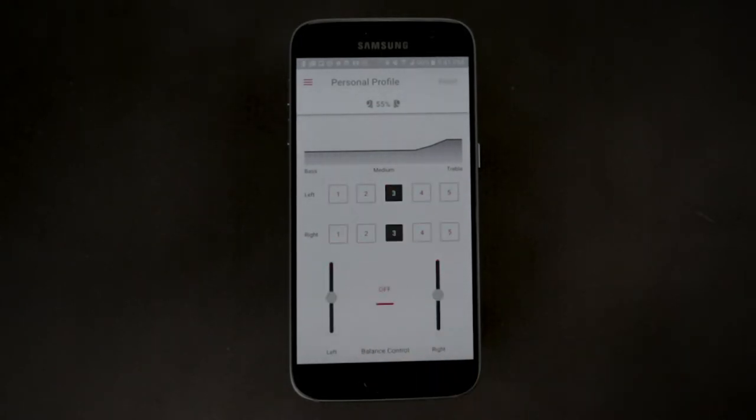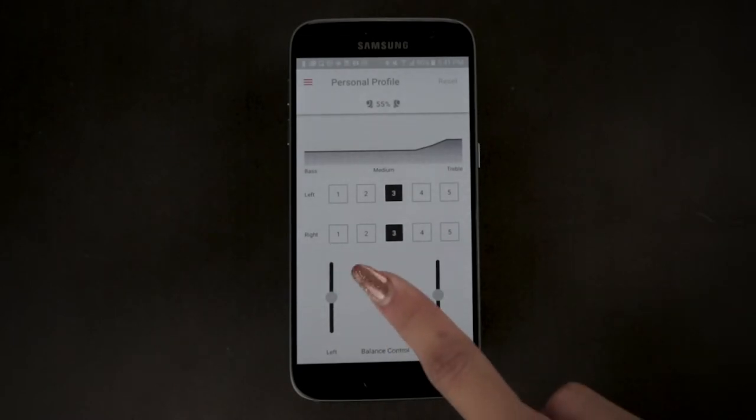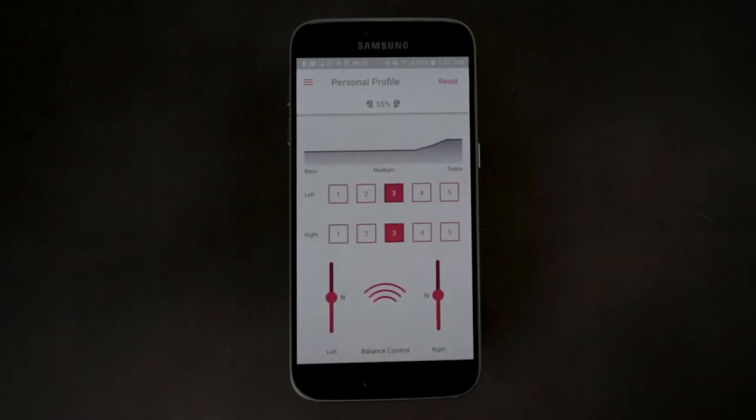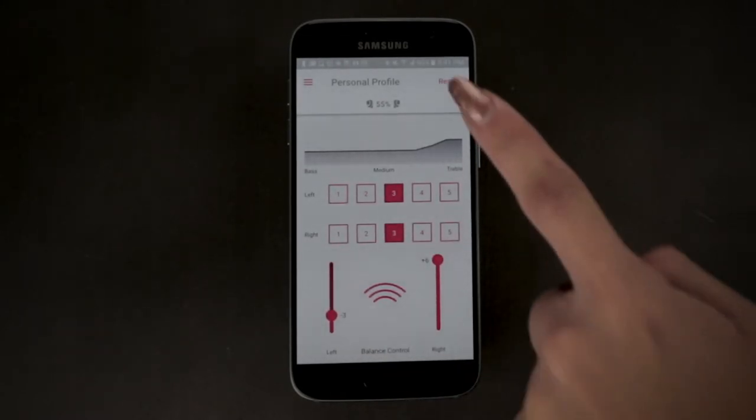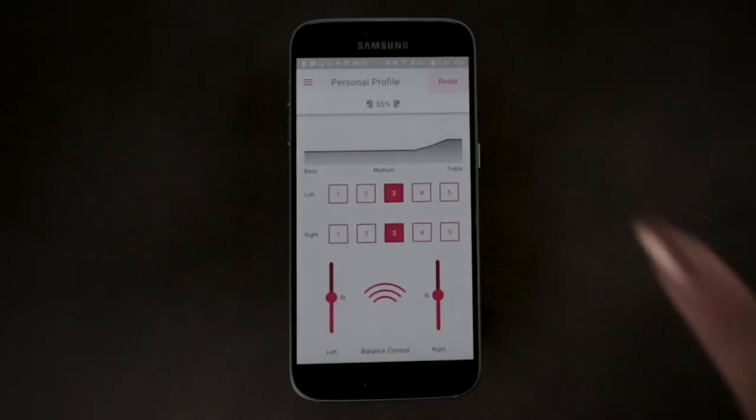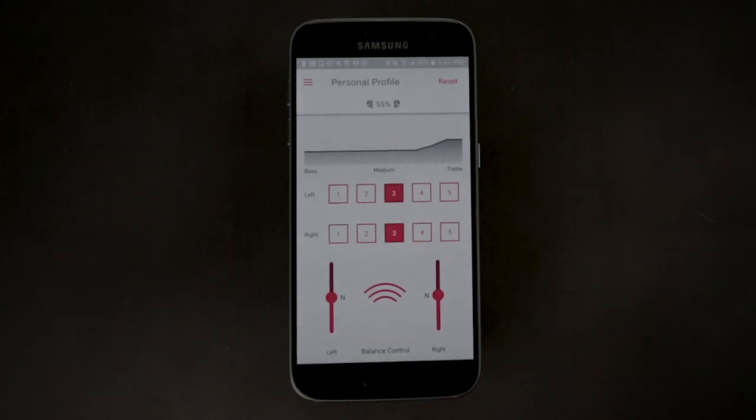You can tap here to turn the personal profile on or off. To reset back to the default, you can simply tap reset in the upper right corner.